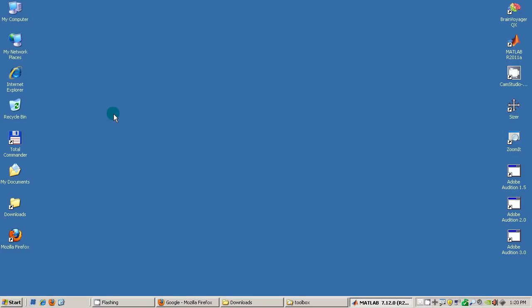So today I want to show you how you can download and install this under MATLAB 2011 under Windows XP. It's principally also the same for Mac OS X and Linux.